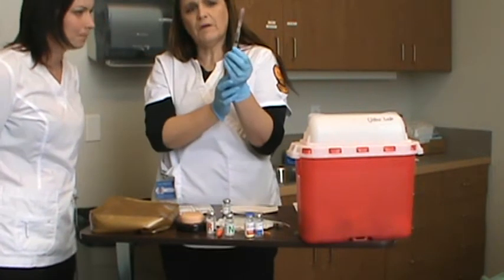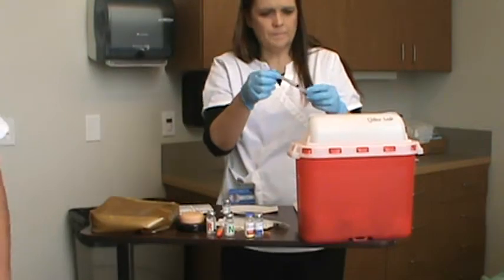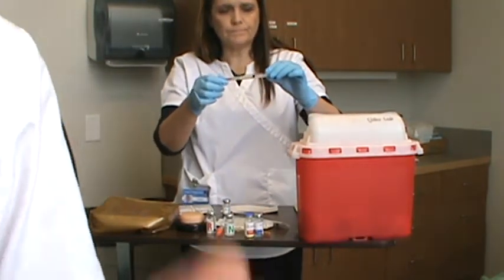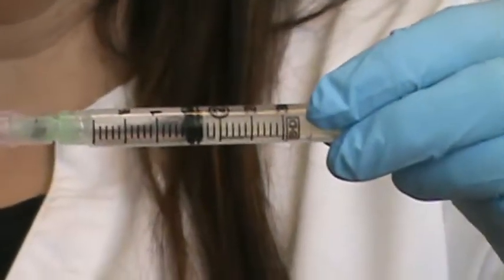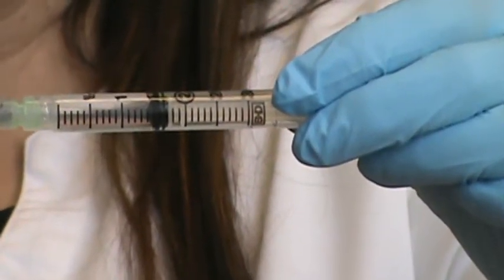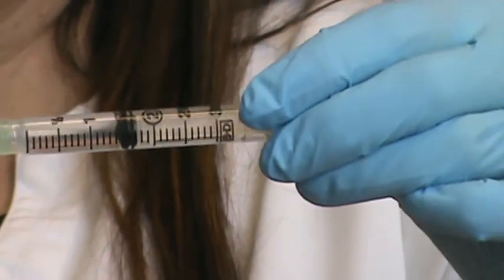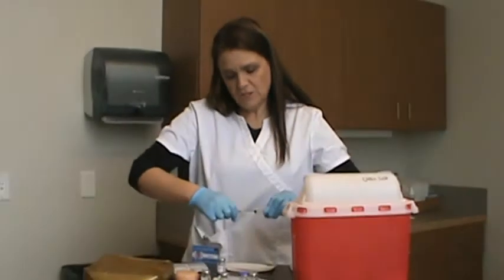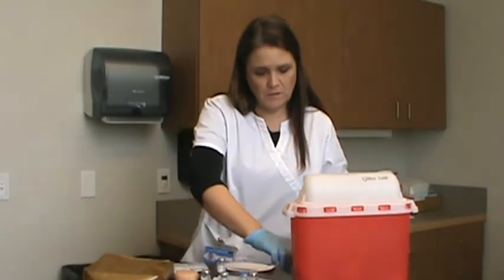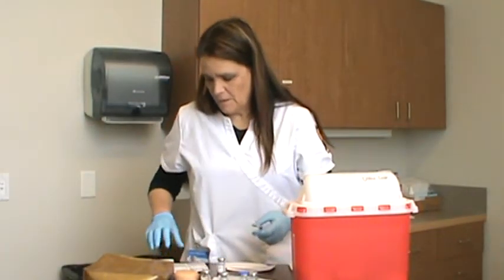Is that right? Yep. Okay. Can you see that? I'm zooming in. Roll it a little this way, other way. 1.5. So I would change my needle out because you're not going to give an injection with that.